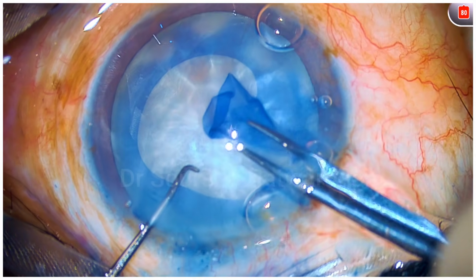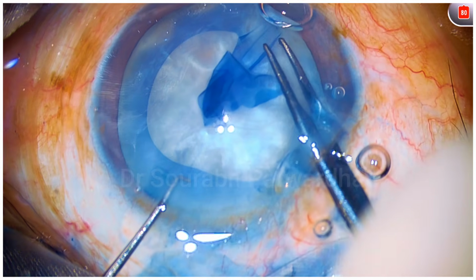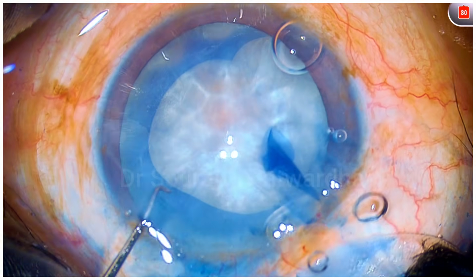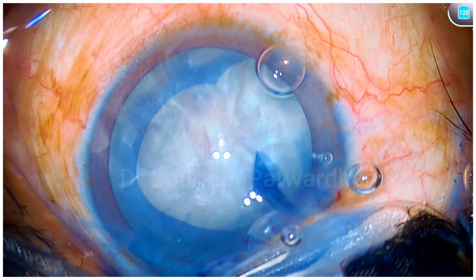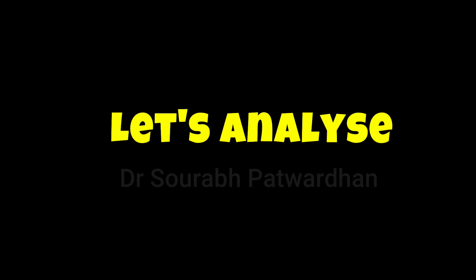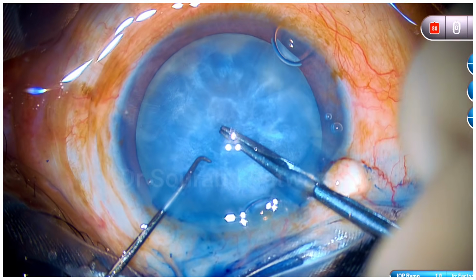Surgeon pulls it back, and with the quick pull, surgeon is able to retrieve it. And what you see in this video is that the rexis is larger than what is required. But let's analyze each small step here and find out the risk analysis as we go. So first nick is made and first flap is created.